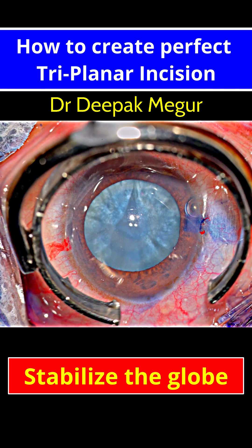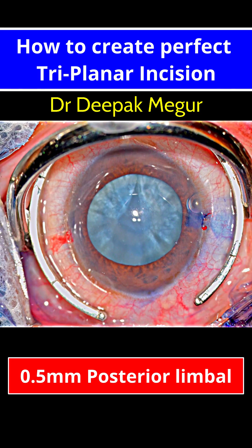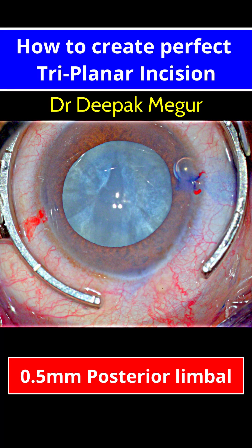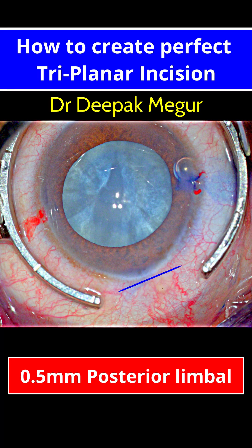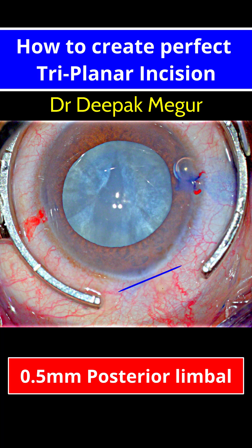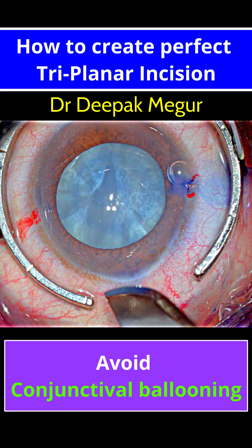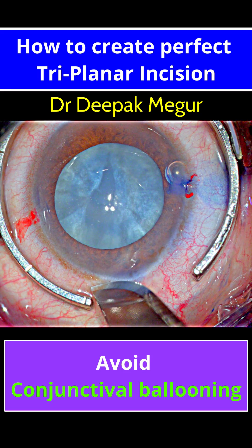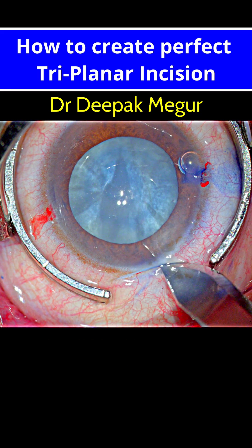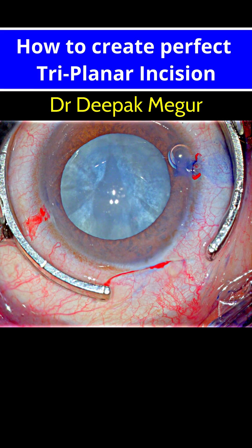The globe is stabilized with the ring. Typically my incision is posterior limbal, based at the conjunctival insertion or 0.5 mm posterior to it. To avoid conjunctival ballooning, I prefer to make a perpendicular partial thickness incision which is slightly bigger than the intended phaco incision.